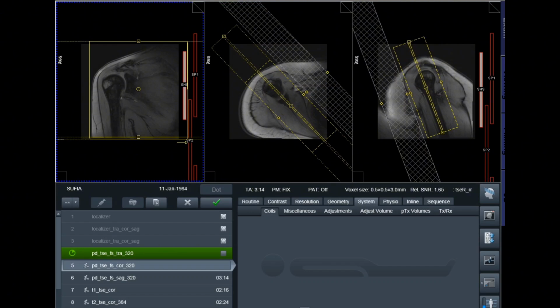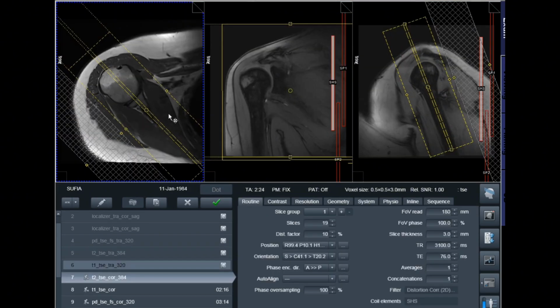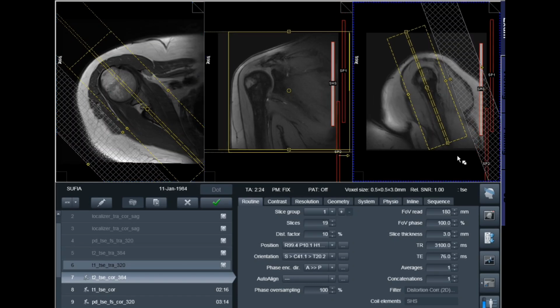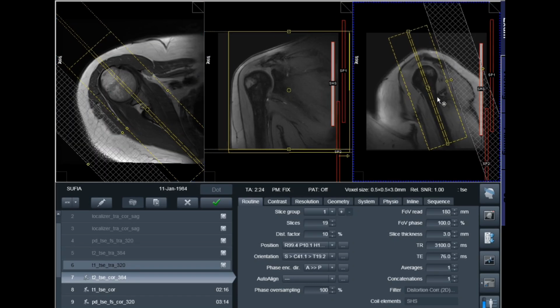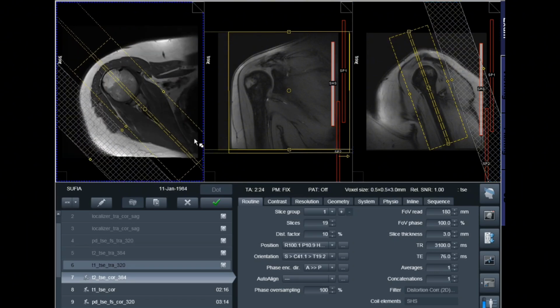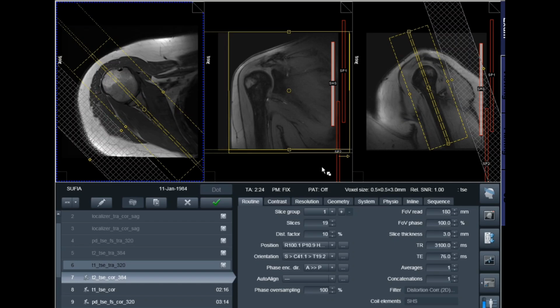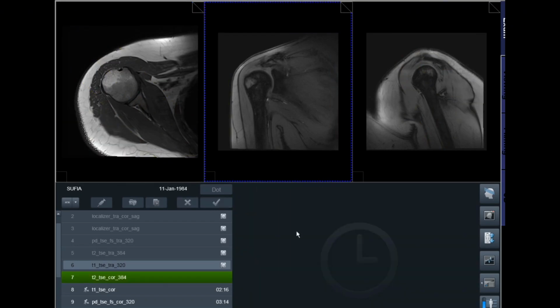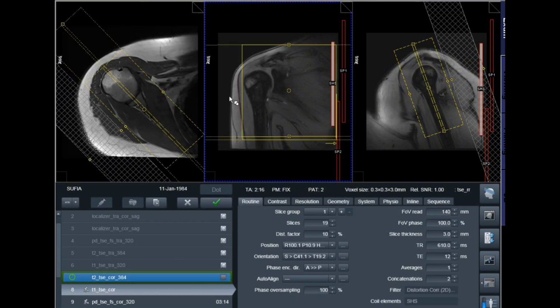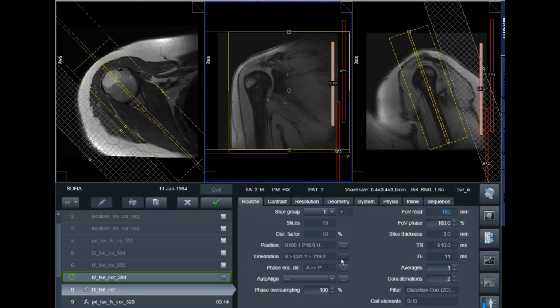Rotator cuff tendinopathy. MRI findings include tendon thickening, increased signal intensity on T2/PDFS, loss of normal fibrillar pattern. Adhesive capsulitis or frozen shoulder. MRI features thickening of joint capsule, obliteration of axillary recess, thickened coracohumeral ligament, synovial enhancement on post-contrast images. Clinically presents with pain, progressive restriction of both active and passive movements.